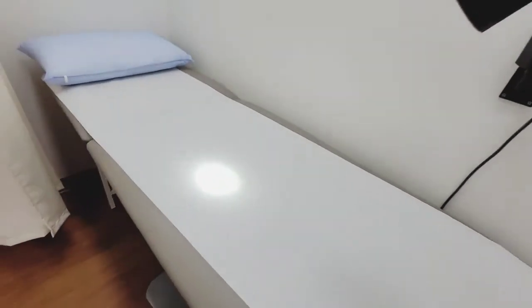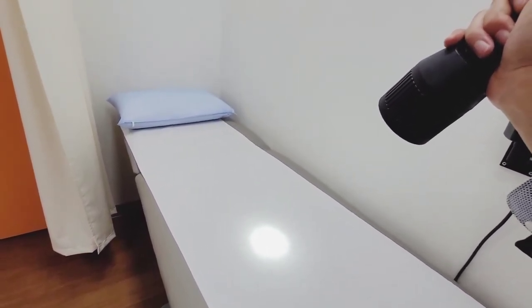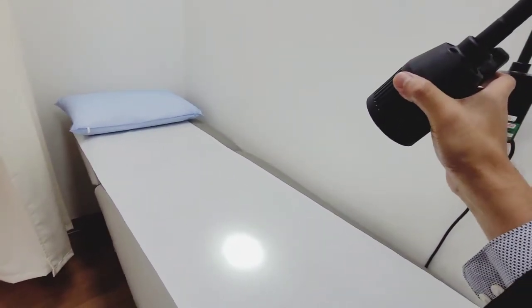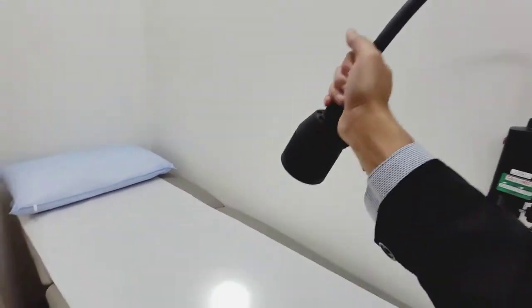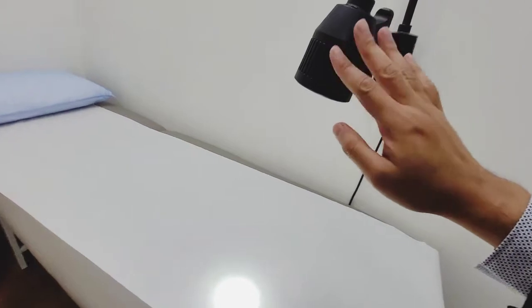So let's just say I need to examine the patient's genital area, and I need good visualization and a good light to see clearly what's happening there, then I will use this light. I can adjust it like that. So this is actually very helpful for me. Turn it off.